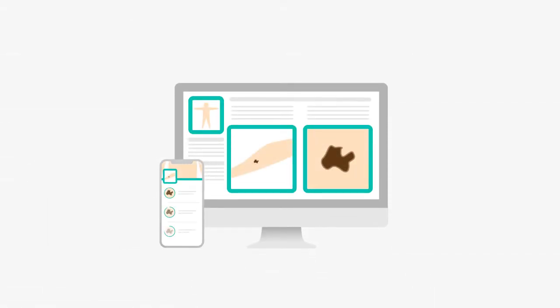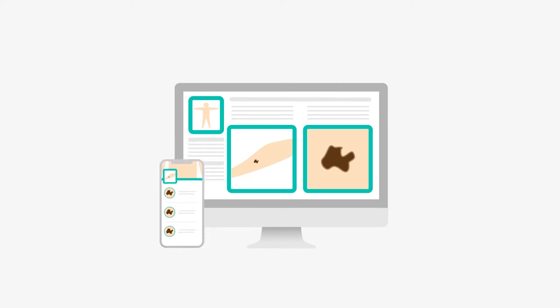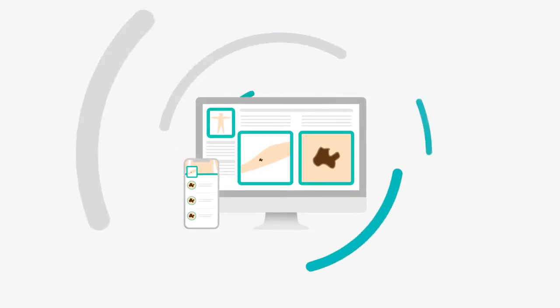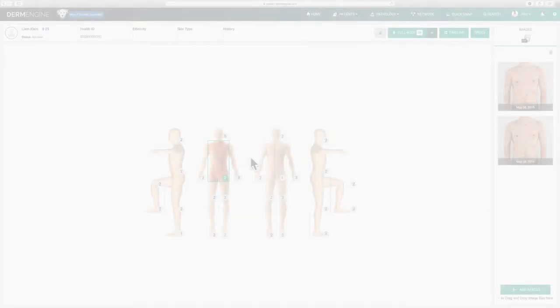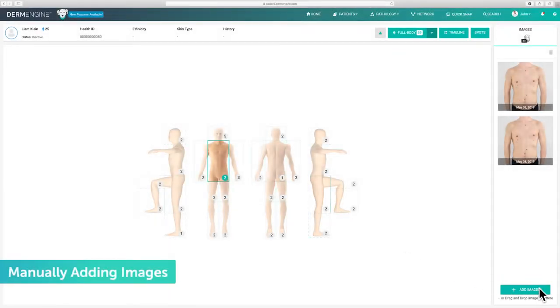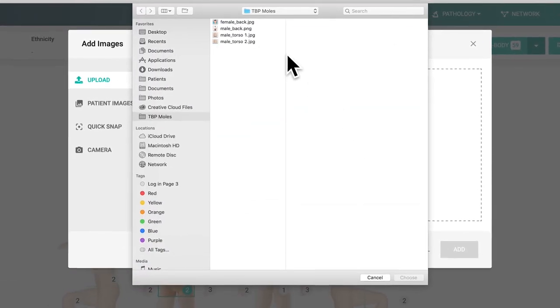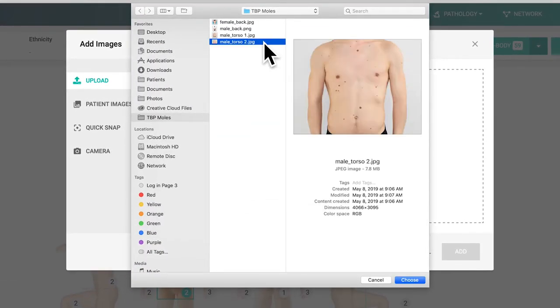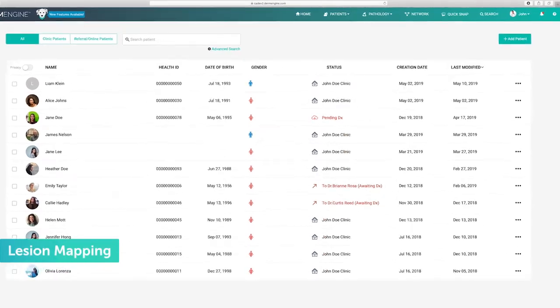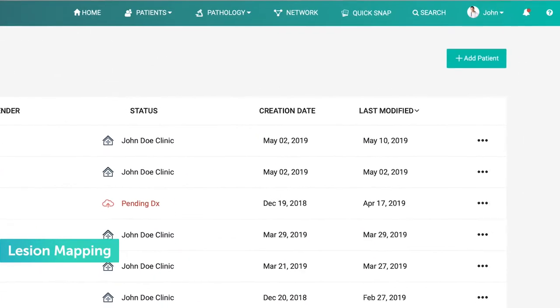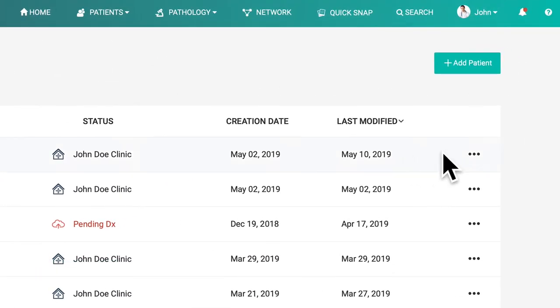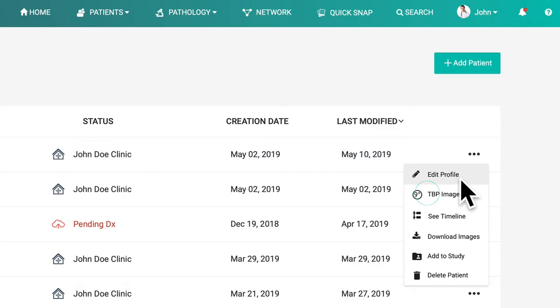Designed to connect seamlessly between your smartphone and computer, DermEngine goes wherever you do. You have the power to take images directly from the DermEngine app where they'll be uploaded to the web platform in real time. Or if you prefer, you can take the images with your own camera where they can be easily uploaded to the web platform. You can now map your lesions — go to your patient and use the three dot icon to select TBP images, also known as total body photography images.